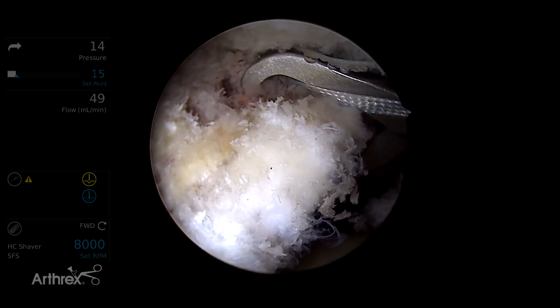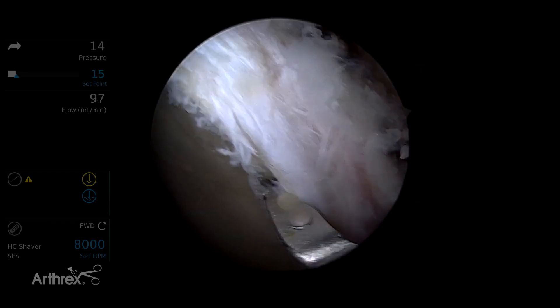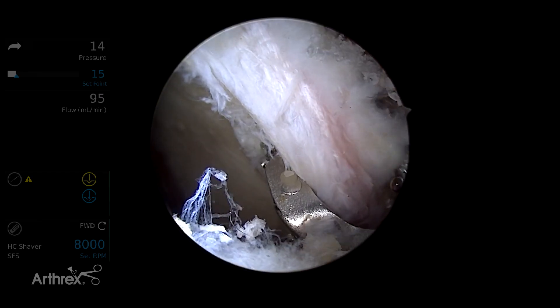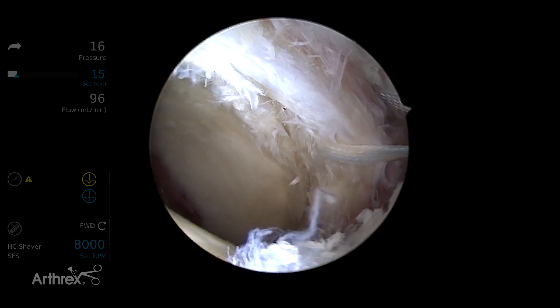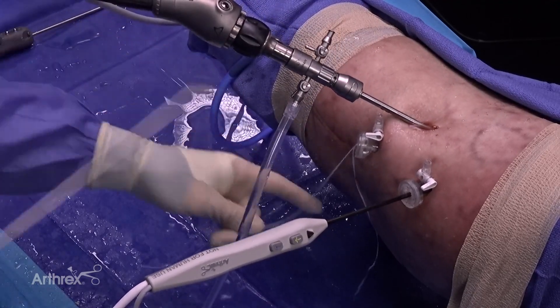At the 12 o'clock position, the hole is identified. The labral scorpion slides off the acetabular rim, easily visualizing anteriorly. The suture is passed and retrieved, and through the DALA portal, we are now ready for anchor placement.